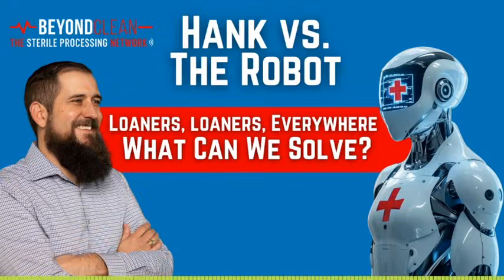Now here's a more innovative thought. Vendor-provided staffing. Some orthopedic and spine companies already have reps who are deeply familiar with their instruments. But what if they expanded that model? Imagine vendor-trained technicians embedded in SPDs or available regionally to assist with loaner processing. They'd ensure instruments are assembled correctly, cleaned per IFUs, and ready to go. It's in the vendor's interest to provide this support. If their sets are consistently processed and used properly, it reflects well on their brand.